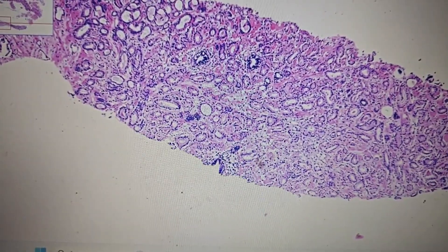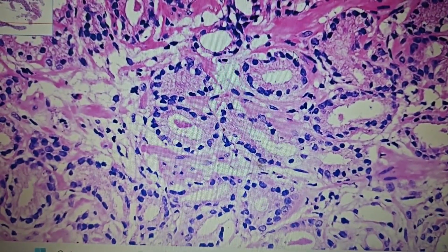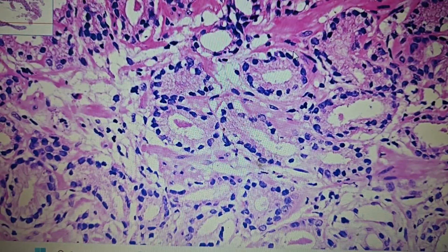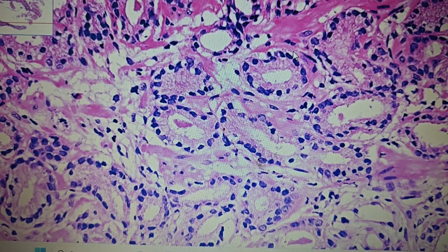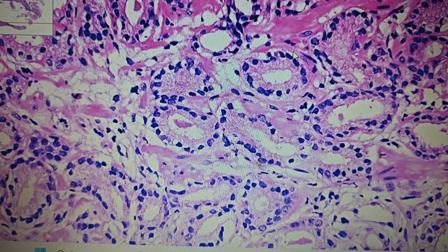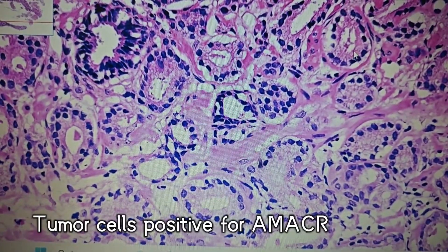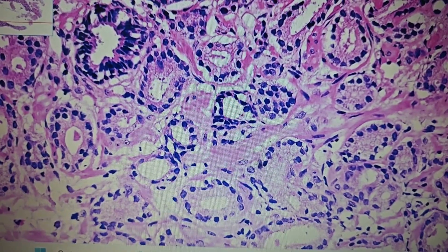Lastly, we should know about the immunohistochemical markers useful in the diagnosis of prostatic carcinoma. In a malignant gland, the basal cell layer is lost, so applying basal cell layer markers in ambiguous cases helps differentiate malignant from benign glands. These markers are p63 and high molecular weight cytokeratin CK5/6. p63 is most commonly employed — if the basal layer staining is lost, we can label that gland as a malignant prostatic gland and confirm adenocarcinoma of the prostate.